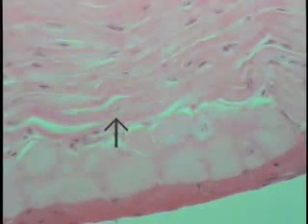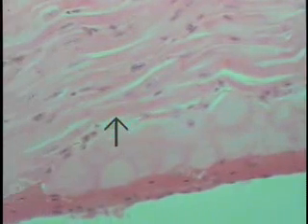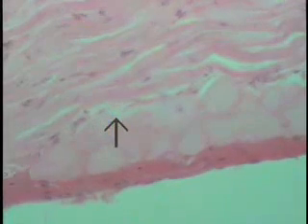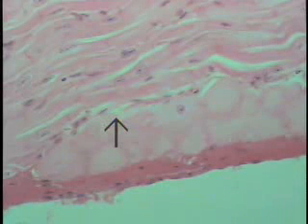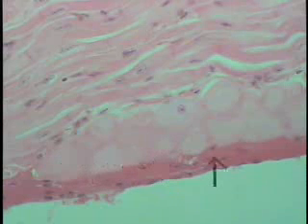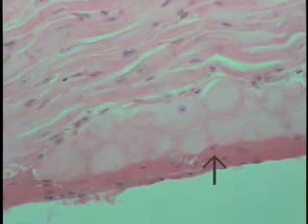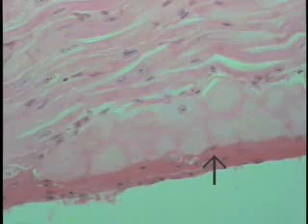I think perhaps the best example, or this small group, as seen in a cross-sectional profile. So these cells are different sections through these very large, flocculent, light-staining cells of the conducting system of the heart, the Purkinje cells.